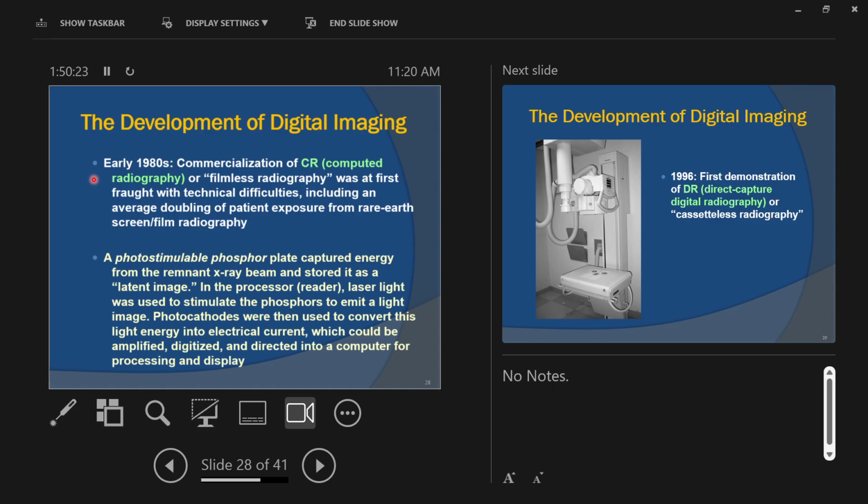Think about it from an administrative standpoint. Film is wasteful. I think you're right, but in what way? What are you thinking? Well, if you make mistakes, you have to store them, but in a digital one, you can delete it, shoot another one, and it's fast.